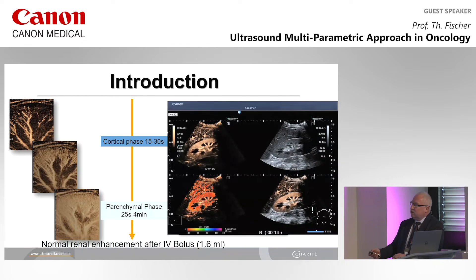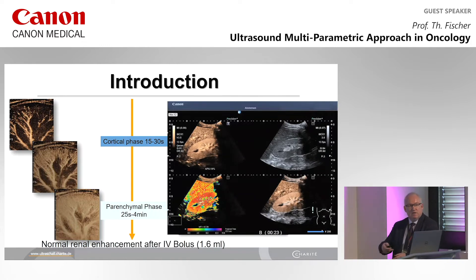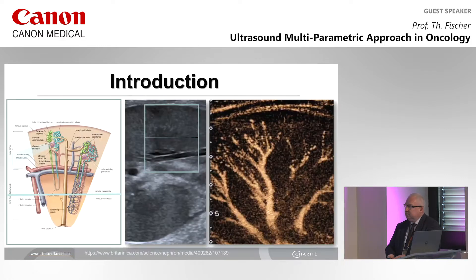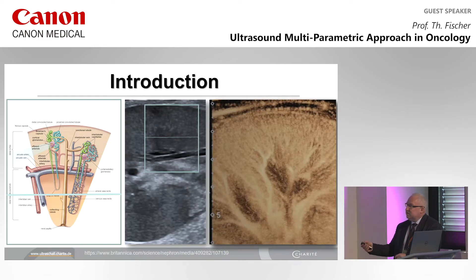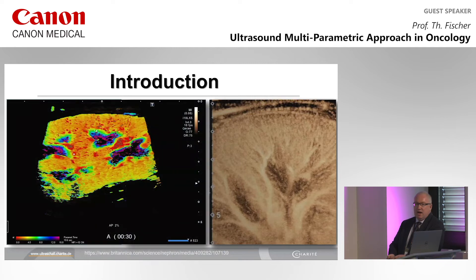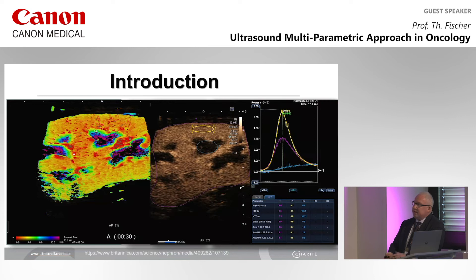This is a regular kidney — you see it works on the right flank where you can use the quad view: inflow, B-mode, overlay mode, and arrival time. Coming back to this fill-in pattern — interlobular artery, arcuate artery, cortical arteries — next step is inflow in the renal cortex, no medullary contrast enhancement, and you can see the anatomical details. We have a tool that corresponds very well with the anatomical overview. Then a fill-in of the pyramids starting from the outer contour to the central portion, with much lower flow compared to the renal cortex. We have time intensity curve measurements, arrival time, parametric imaging, and quantification — a lot of tools available.